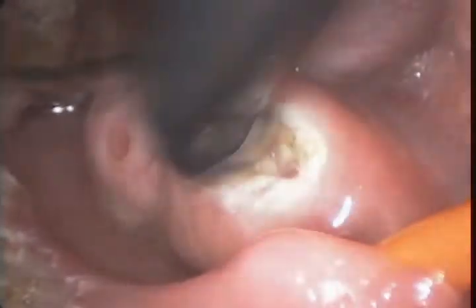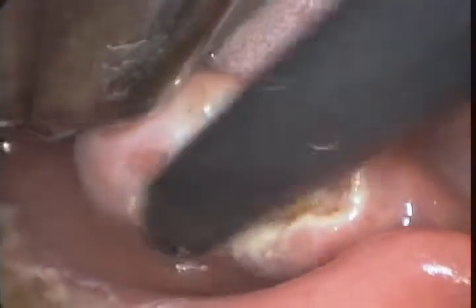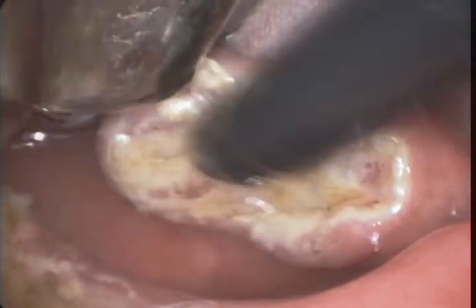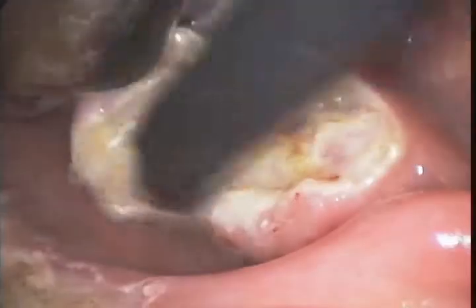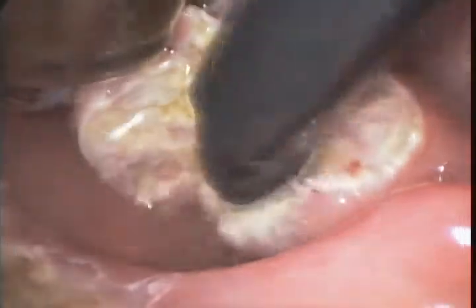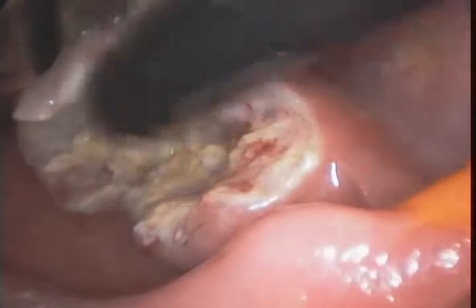So I'm going to turn it back up to 9. Again, a hovering motion, hovering over the tissues, keeping the tip in constant motion to maintain your saline interface. When you do this correctly, you never experience any clogging, and you also, as you can see here, get no bleeding. You get very precise tissue removal in comparison to the microdebrider. Simultaneously, you get good hemostasis throughout the procedure. And in fact, many times when I use the coblation, I don't really have to do much coagulation at all at the end. Whereas when you're using the microdebrider, you end up coagulating almost the entire surface.